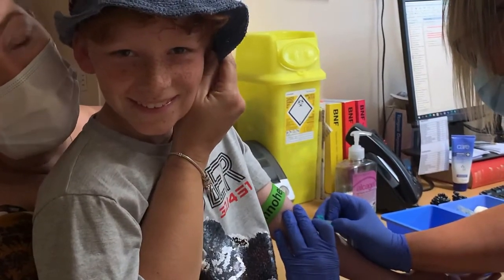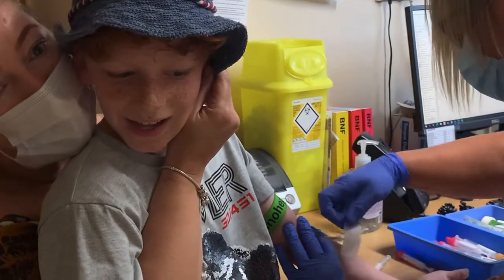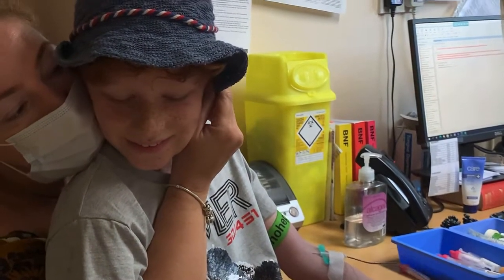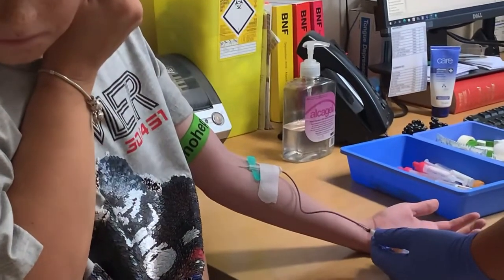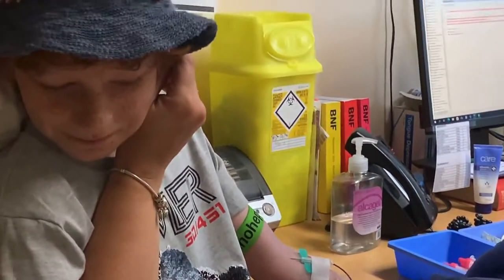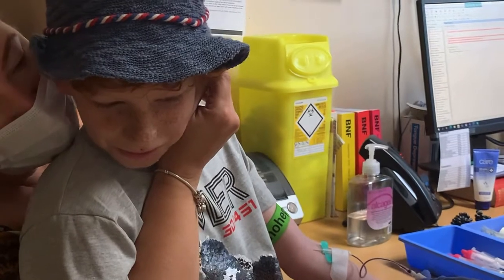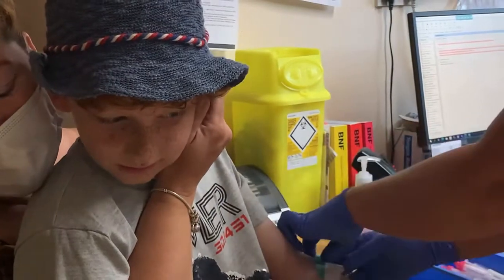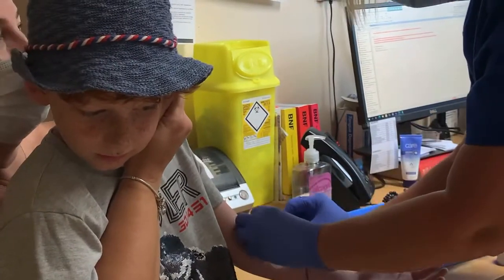Remember all your YouTube fans who haven't had a blood test — they're gonna look at Bailey and think he's brave. I did feel it pinching going in, just the needle going in. Is it done now?